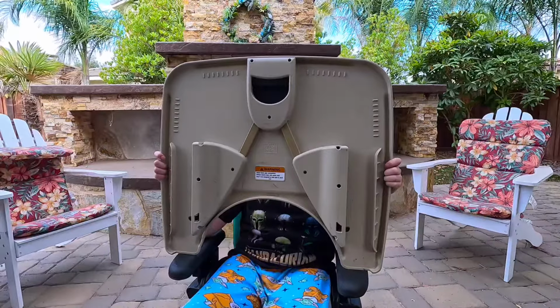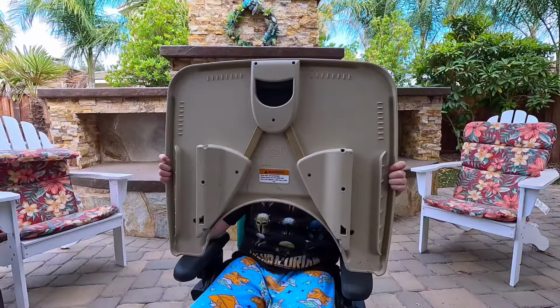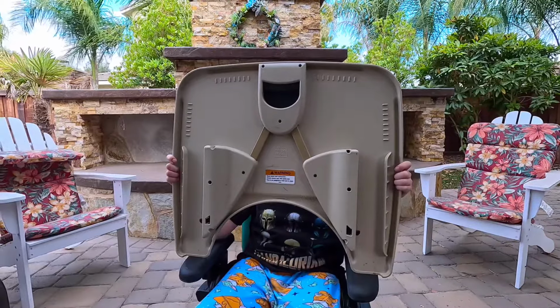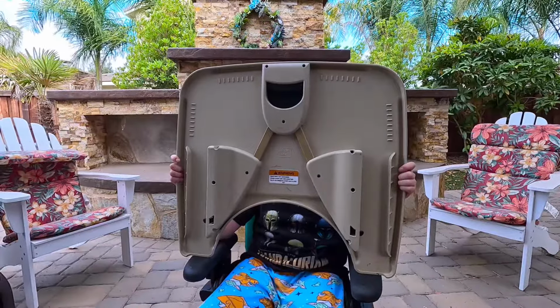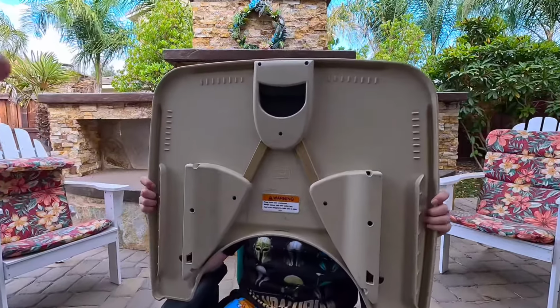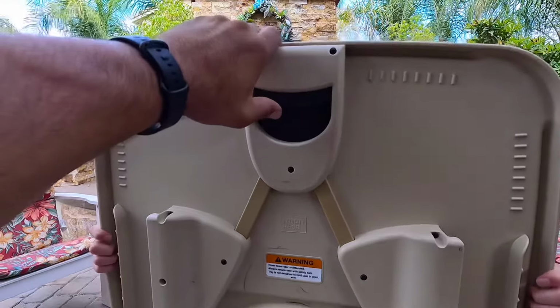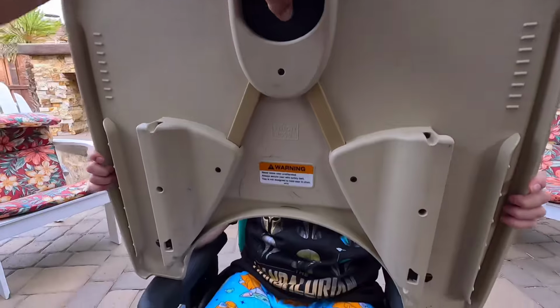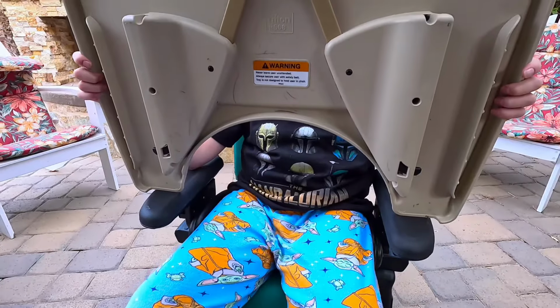It's removed very easily and installed very easily also by simply gripping the little handle and trigger that's in the front of it. So I will show you that right now. It's right here, and you just close it together. It's not very hard to do, and it installs on both the armrests. So we'll go ahead and do that right now.